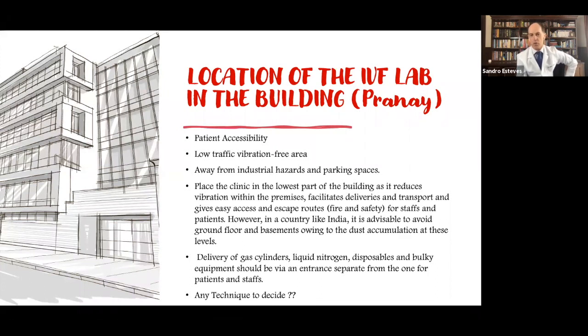To my point of view, one of the fundamental things that I do when I consult for clinics willing to start a new lab or renovate a lab is planning. We need to dedicate a lot of time to planning. This is very important. And we need to have technical expertise. You can bring in a company, but if you are not the expert, they can sell you things that you don't want. And in a few years, you will want to resell, and it's almost for free. So you need to acquire and learn the technical expertise to understand, even when these companies come and sell you air quality control. You need to have a deep understanding.